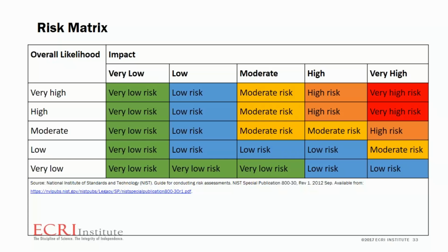So from there, you can prioritize your action and plan remediation. This would involve scheduling. Do you need to do this now, or can it wait a month, or can you do it within your PM cycles? Is the risk low enough that the remediation costs are more than the actual risks, and maybe you can accept the risk? Or maybe you need to do this right now.